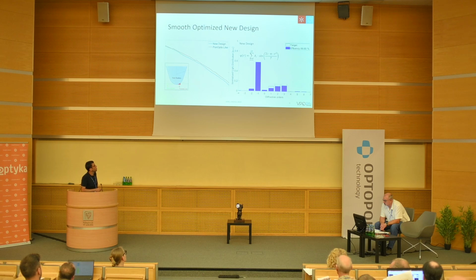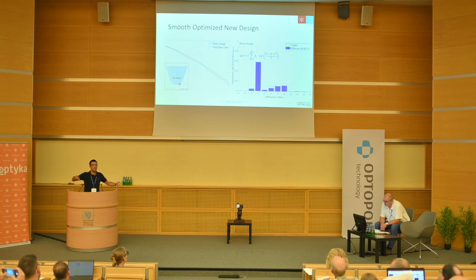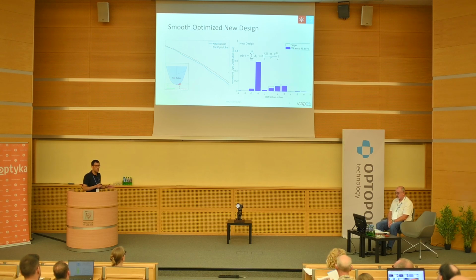If I put most of the light inside the range of focus that the patient is going to use, it means that I have less light outside that range of focus that will negatively contribute to the image quality. So this is the main idea. If you are able to make a clever design that puts more light in here, then you have less light outside contributing to that halo.